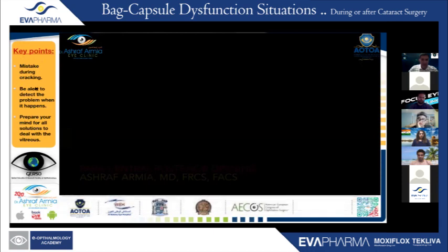So my key point here is a mistake during cracking. You should be alert to detect the problem when it happens and prepare your mind for all the solutions to deal with the vitreous.